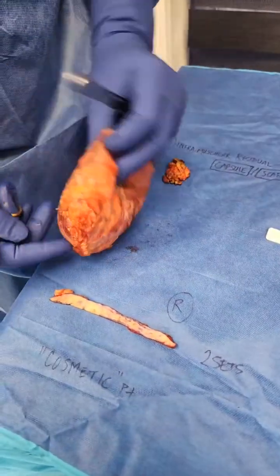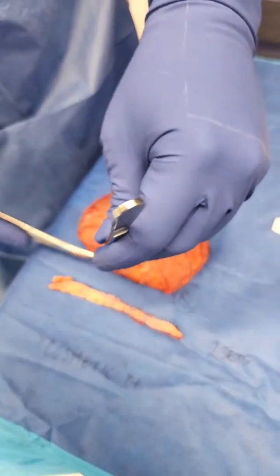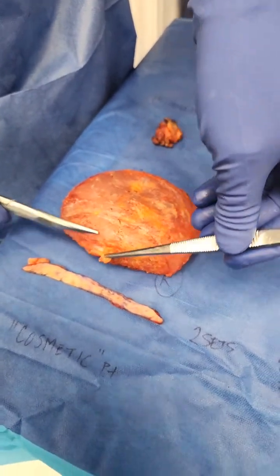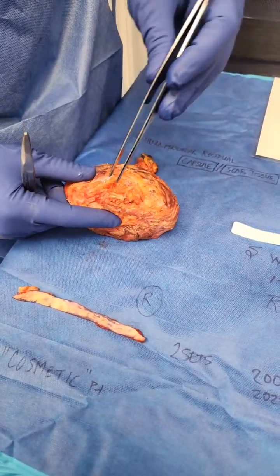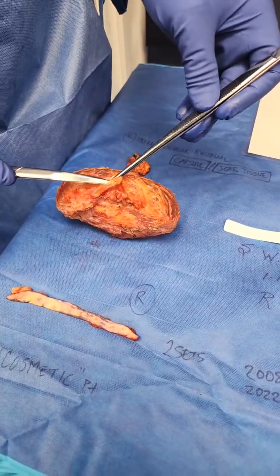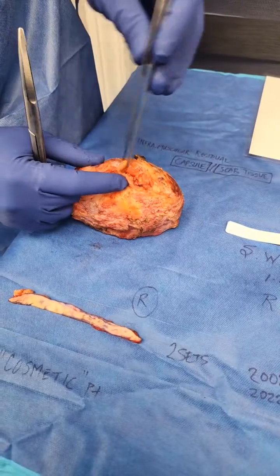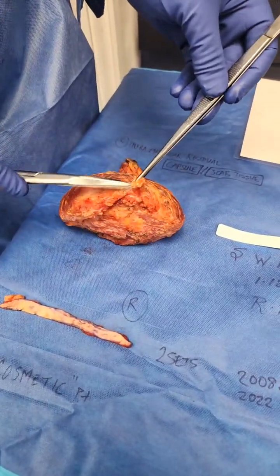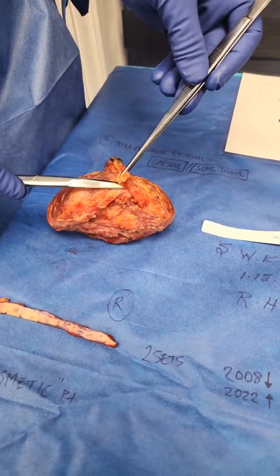I just want to go ahead and show this tissue right here at the bottom. As I cut open, there was suture that was seen. Look how thick this tissue is. As you can see right here, it's like a band. I had to remove all of this so that the patient would have all of the scar tissue removed. Look how thick this is. I'm having a difficult time just cutting through it. And remember, anything that feels abnormal, palpates abnormal, I remove, because that is inflamed tissue.